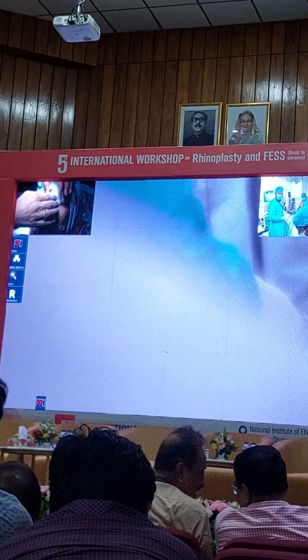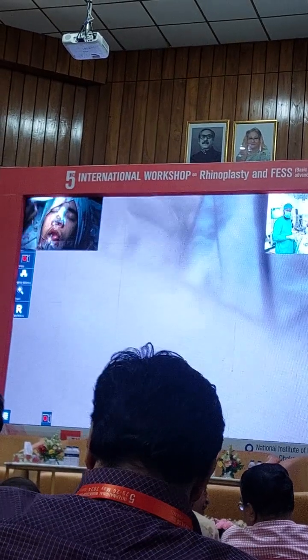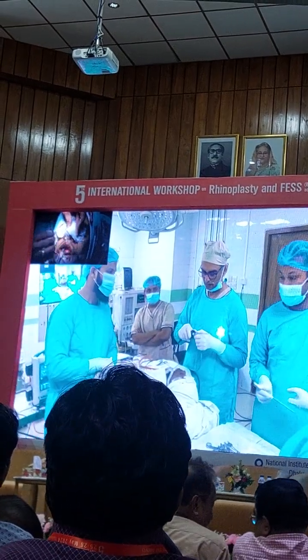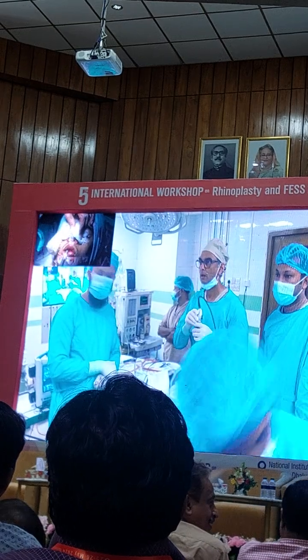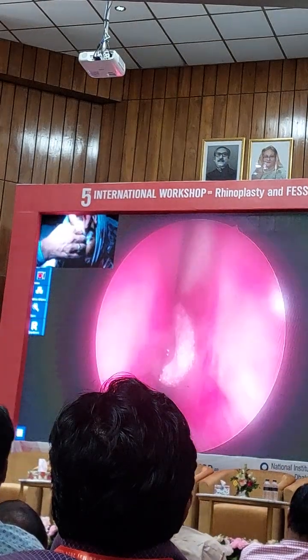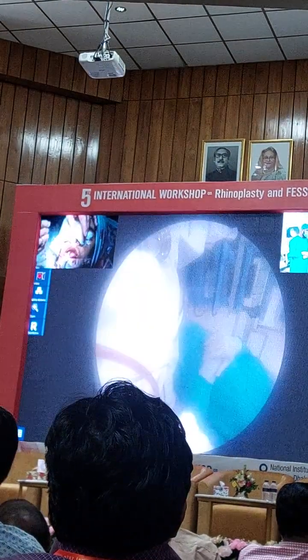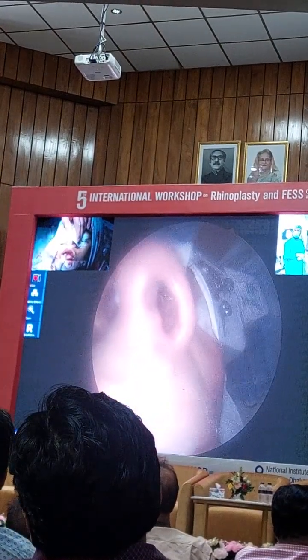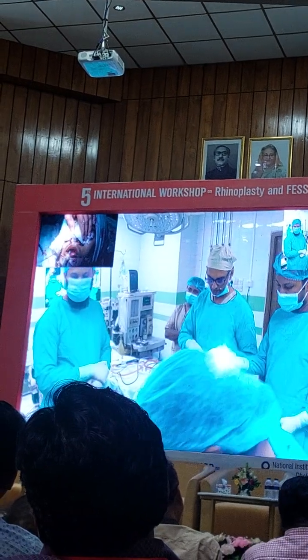No, this is 70. This is 30. So where is the 45? No. Okay. So at the moment we have a 30. Which I cannot see anything. So I think this 30 scope has been abused beyond help. No, we're not getting a clear picture. Okay, give me that 70 because I can't see with the scope.